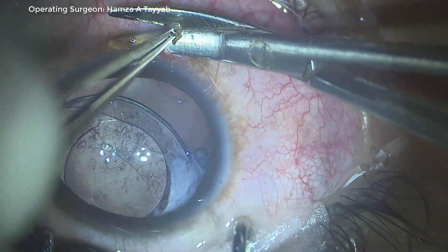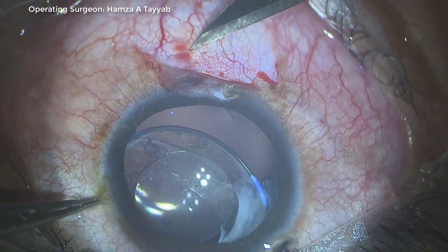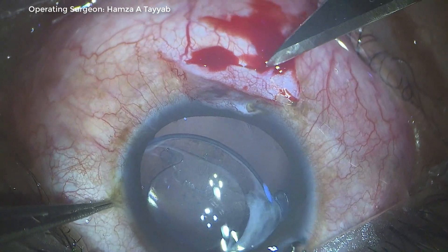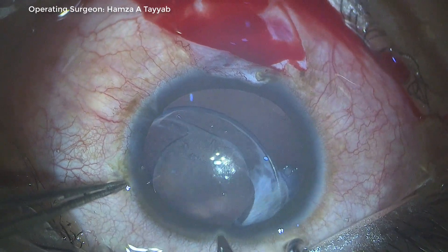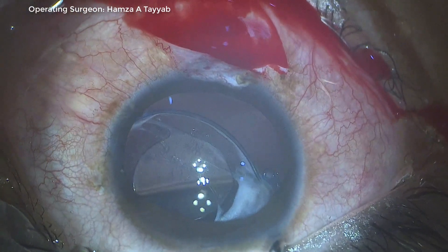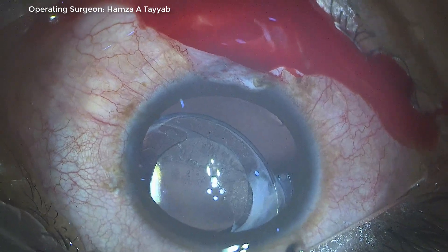I decided to take up this case. I make a small partial thickness scleral groove 2 mm from the limbus, where I plan to bury the knot of the suture which will be tied to the CTR. I make a paracentesis 180 degrees opposite to the scleral groove that I've made.